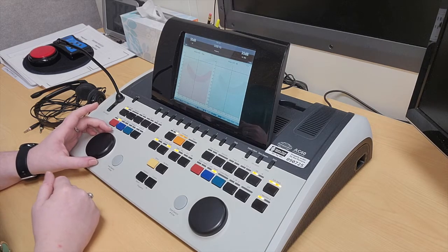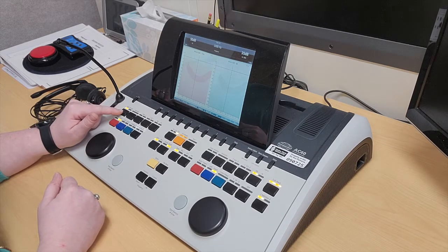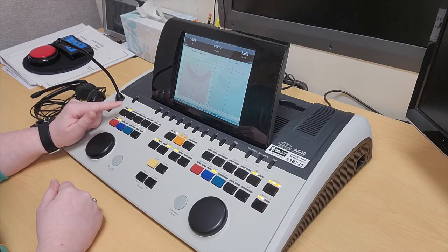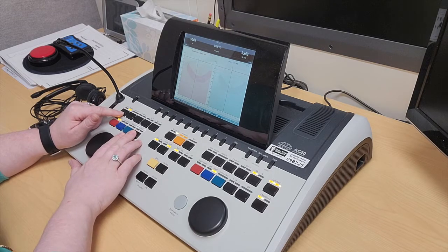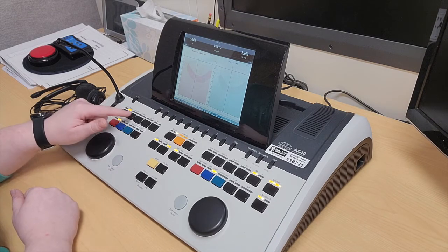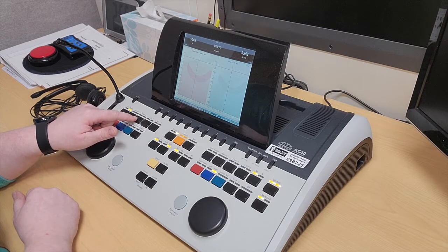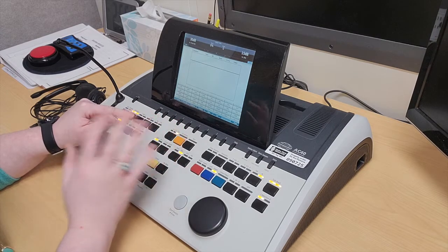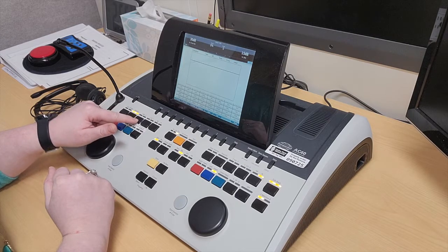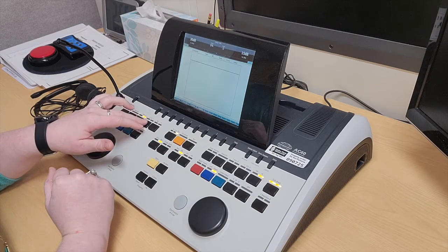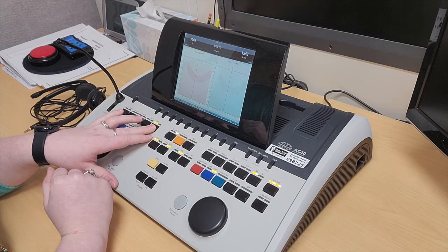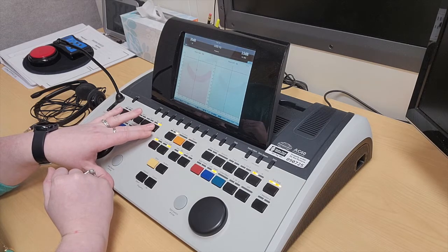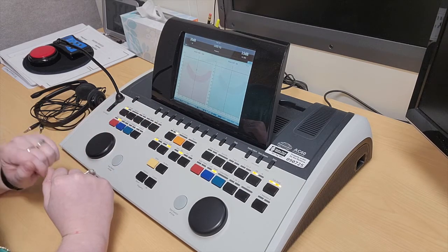To select the stimulus type, we would go up here. Right now it's on tone. We could change to warble, especially if we are in sound field. And then up here, wave file goes over to the speech section, and then mic one. Here's narrow band noise or white noise. I'm just going to go back to tone.